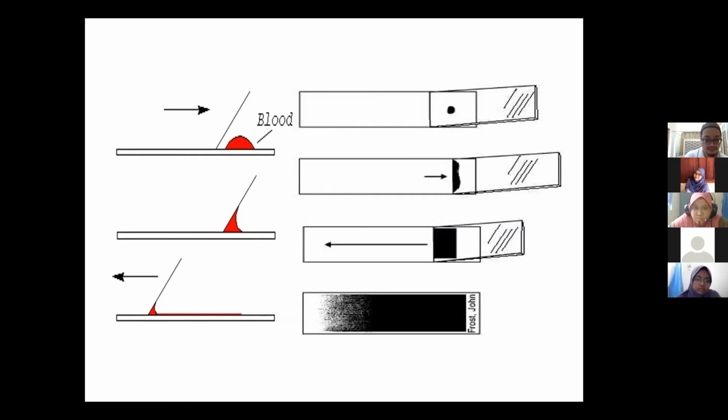Okay. So ni mungkin tak apa clear, but you can see this is the drop where the blood was dropped, and then the blood was smeared across here. Sepatutnya dia letak sini lah. Selalu kita letak kat sini, tapi orang ni terbalik. Okay, dia buat okay, tepi-tepi tak sampai, very nice. And then there is a curve, a crown shape area. We call this a feathered edge. Sisi yang macam bulu pelepah yang cantik, dia punya crown dia. Okay, this is the kind of smear that you want to produce. So it is thick and then it begins to thin, very thin.